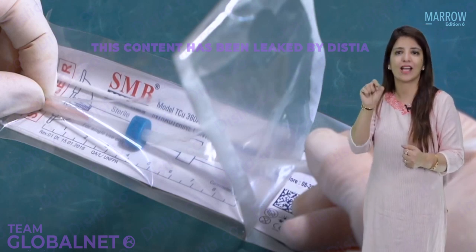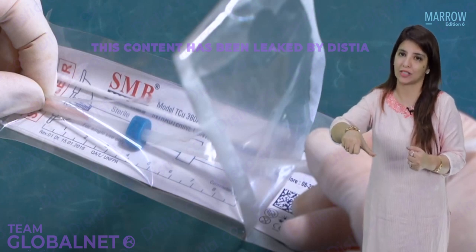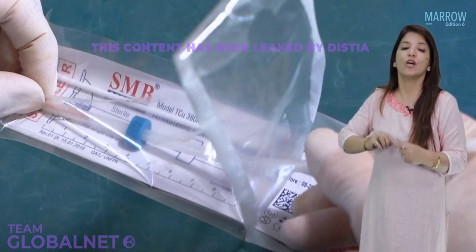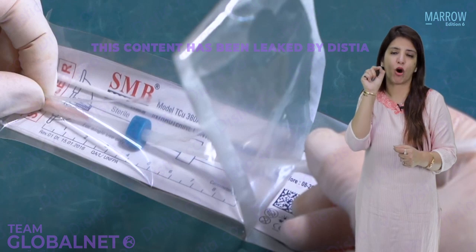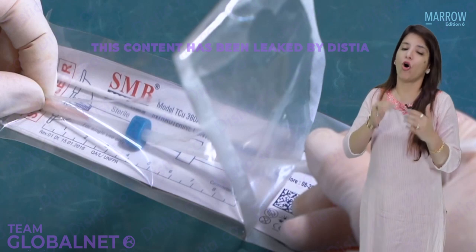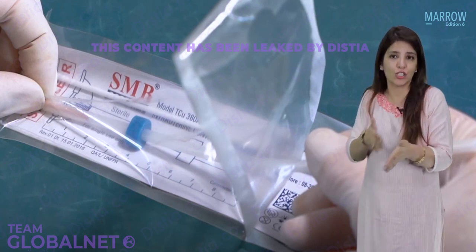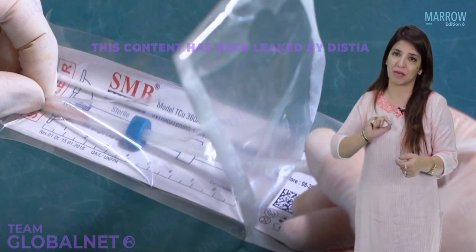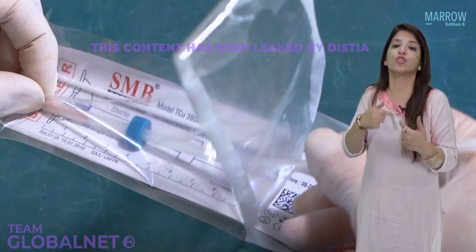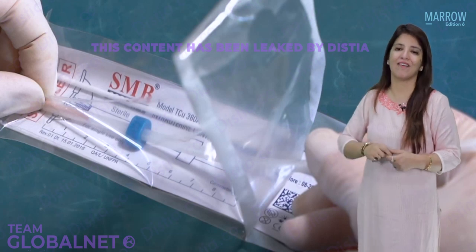Once this flange is lying at the 8 centimeter mark, you are going to hold or stabilize it with your thumb. And now again you are going to move the inserter rod forward so that the tip of the copper T coincides with the tip of the IUCD drawing made on that white colored sheet. Right? So let's have a look at this video.